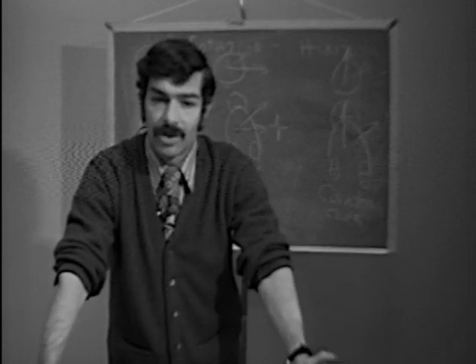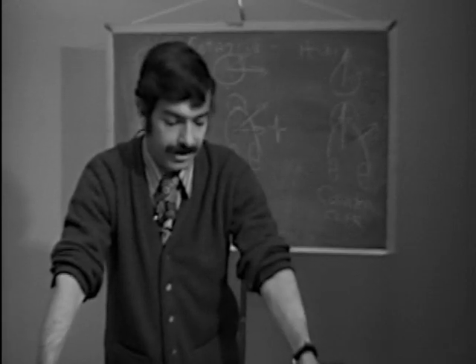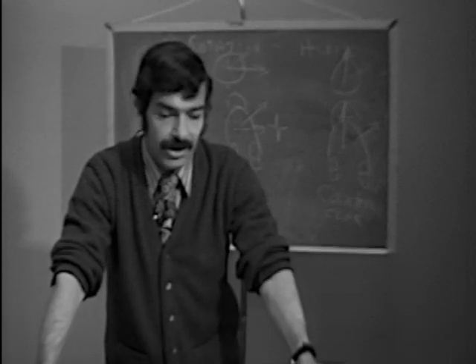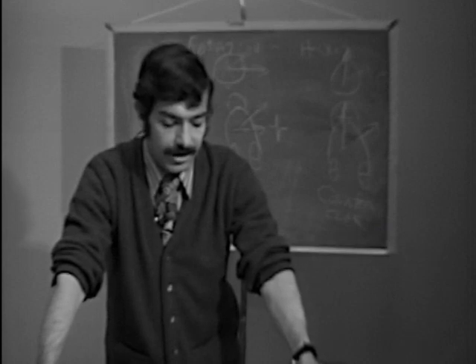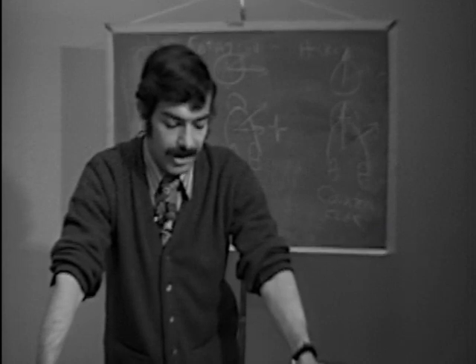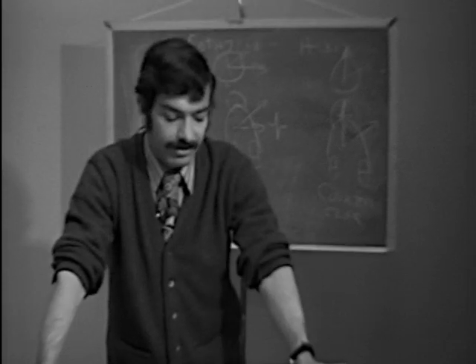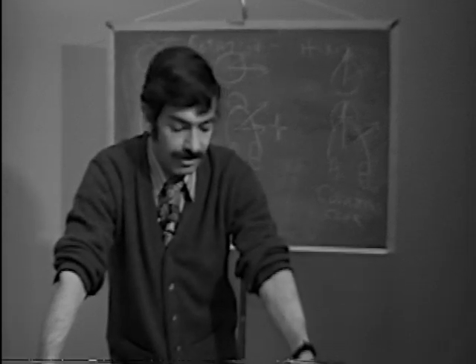One of them, of course, is heart rate. You can't waste a lot of time determining heart rate. You have to do that quickly and easily and approximately correct. The intervals, extremely important. Can't live without learning intervals. Nomenclature, not that important. Taking the EKG, everyone knows how to do that, but that's not that crucial for reading it, certainly.